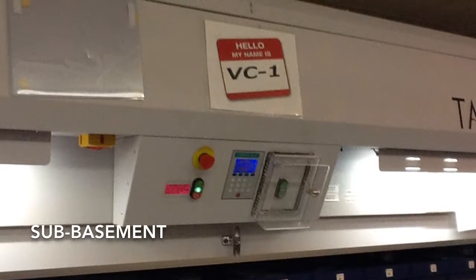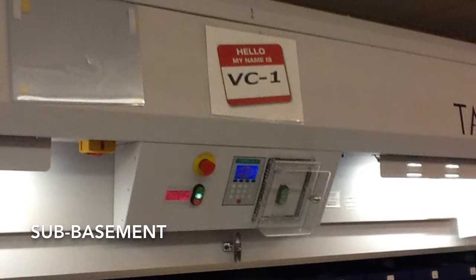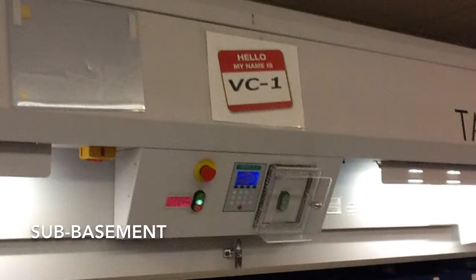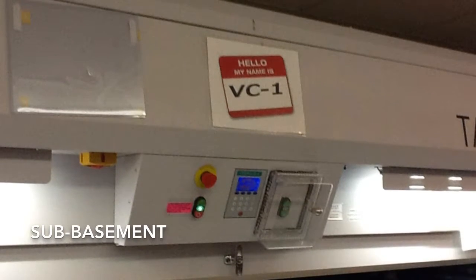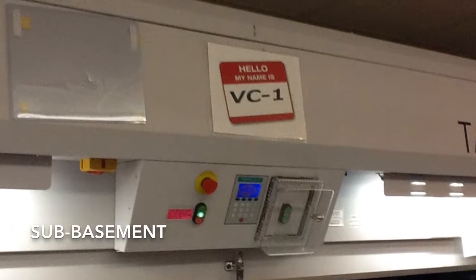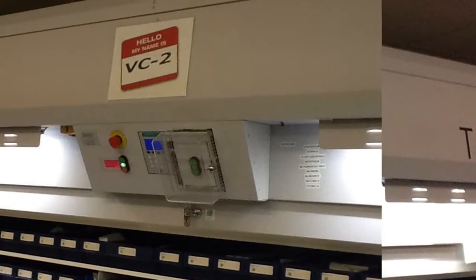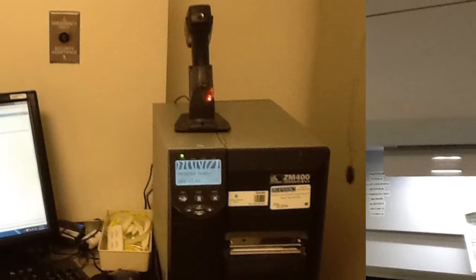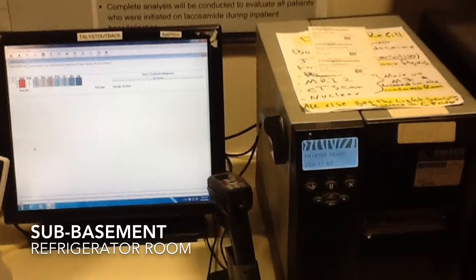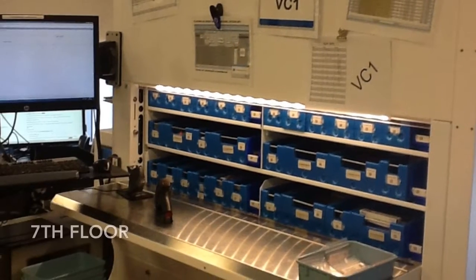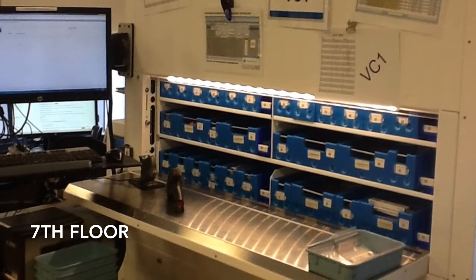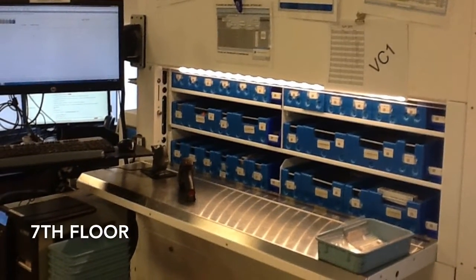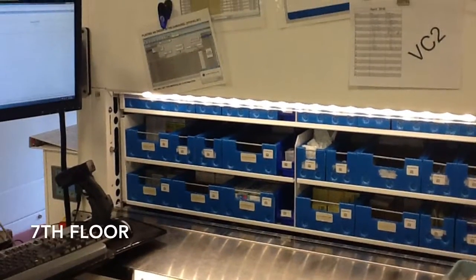First, we will talk about carousel names and locations. In the sub-basement, there are four carousel locations: Vertical Carousel 1 or VC1, Vertical Carousel 2 or VC2, Central and Refrigerator Room. And in the 7th Floor Satellite Pharmacy, there are VC1 and VC2.